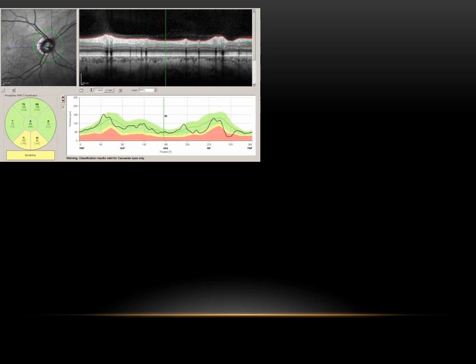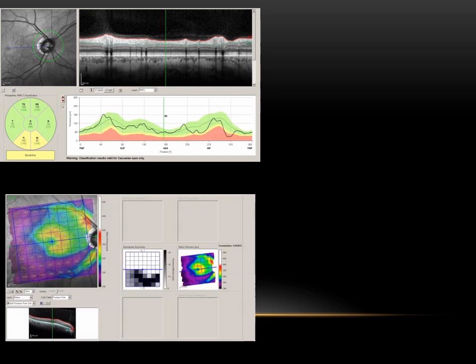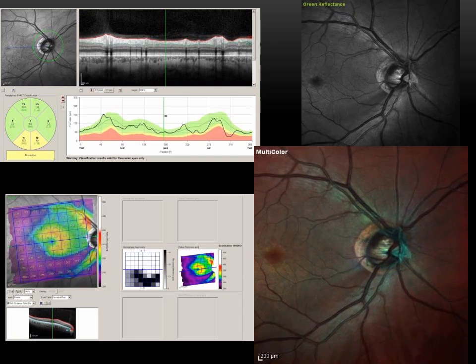This case example shows a right eye classified as borderline nerve fiber layer by OCT measurement, with a slight inferior loss that barely reaches the abnormal range according to the normative database. To confirm this, we use a macular thickness map showing an infero-temporal groove in the total retinal thickness as well as loss of the ganglion cell population infero-temporally. One can be doubly sure with the help of multicolor, which shows the inferior loss, and green reflectance, which shows this loss very clearly.